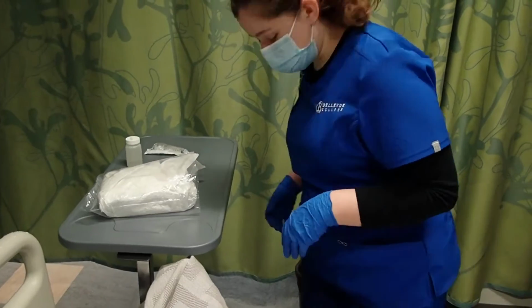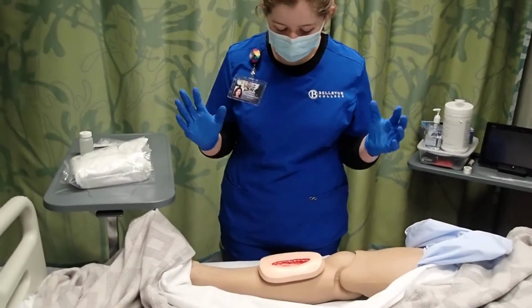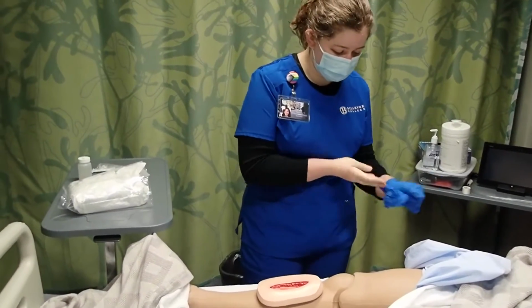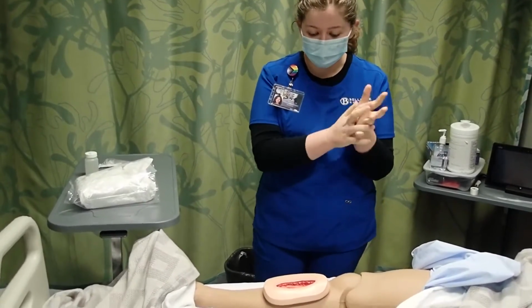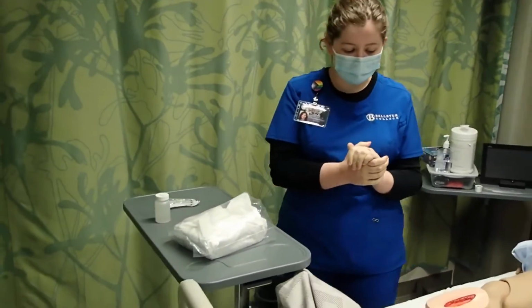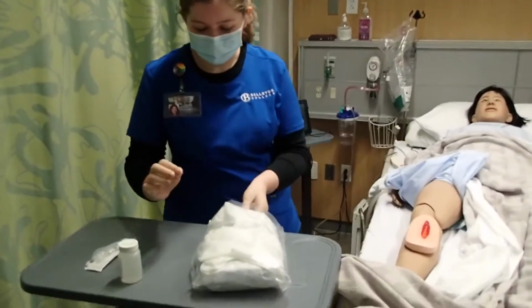Discard of that. Now that the wound is exposed and the dressing is removed, I'm going to go ahead and remove my gloves. Perform hand hygiene once again. And at this point, I'm going to prepare to put on the new sterile dressing.